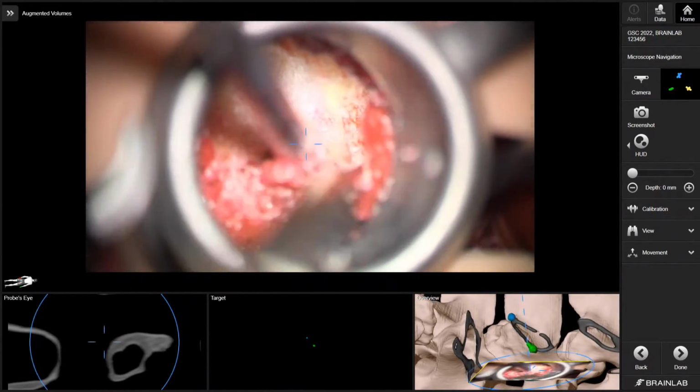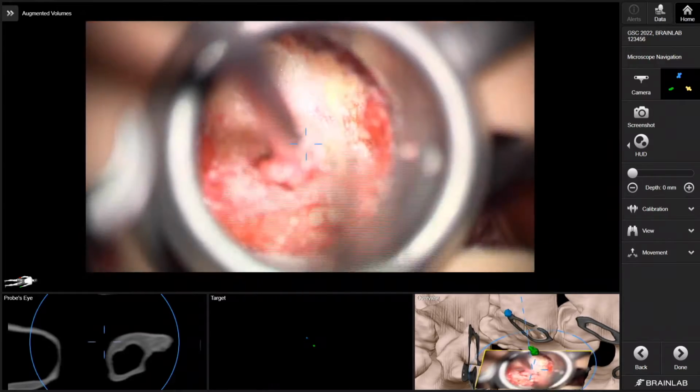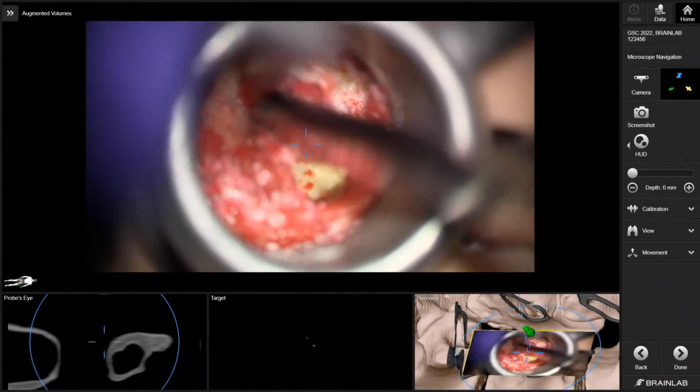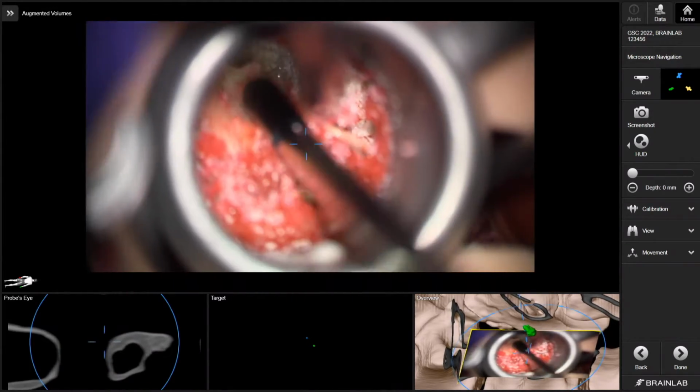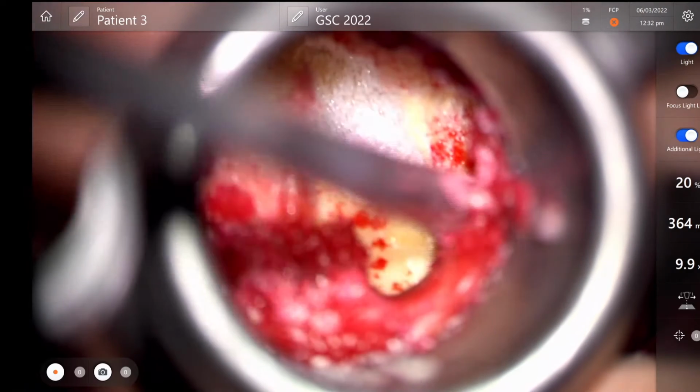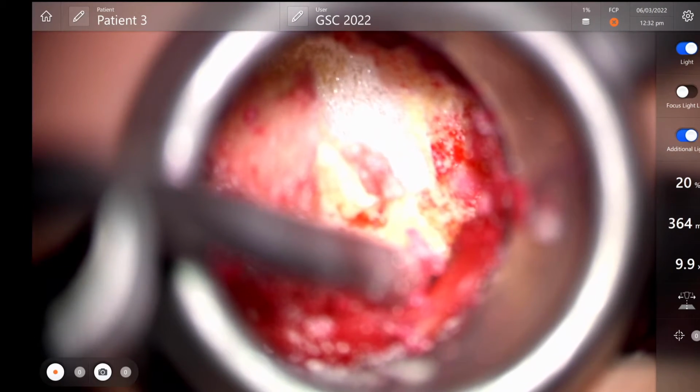And to identify the lateral pars. If you don't have really any kind of imaging available, then there's a tendency to drill into the L4 pedicle or to stay too low, but hopefully with navigation you can avoid that.